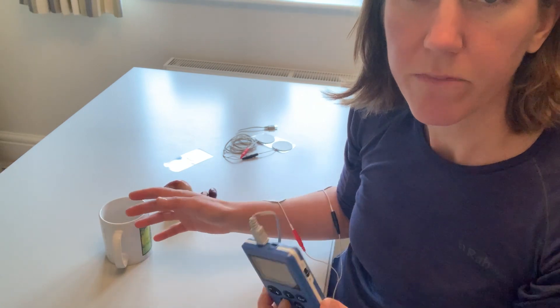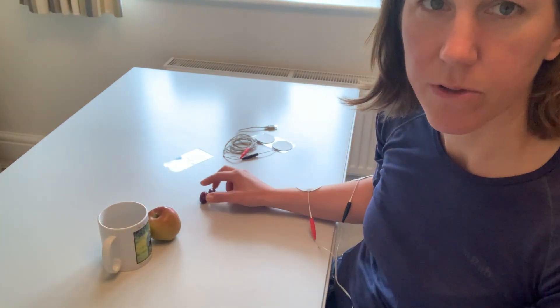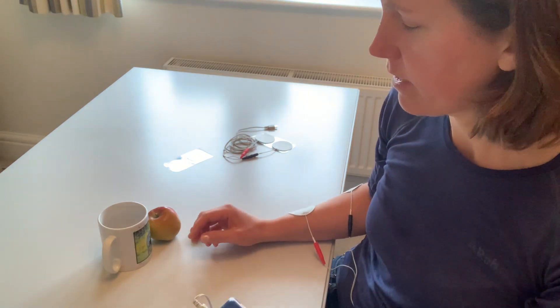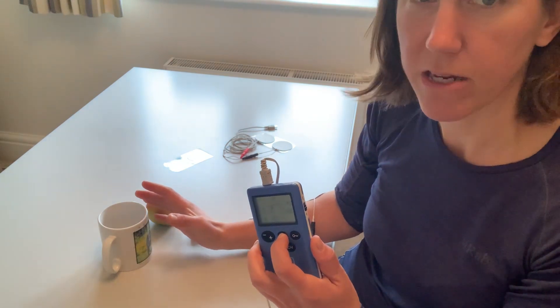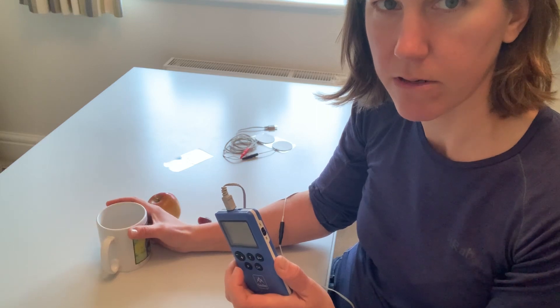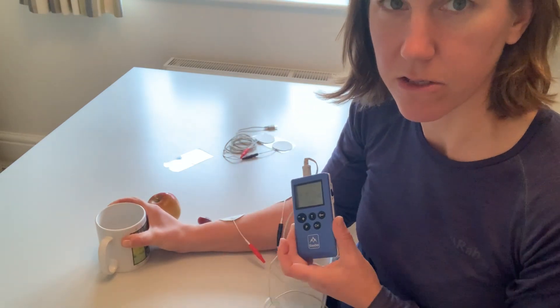What you choose will depend on how tight your hand is, how much opening you've got, and what your weakness is — so I've got a variety here. If I go for the larger object, this is more of a gross grasp; it's a little bit easier. I'm pressing the stimulation to open my hand as I reach forward, and as soon as I think I've got my hand around the object I can let go and then actively close — the stimulation device is doing nothing at that point.